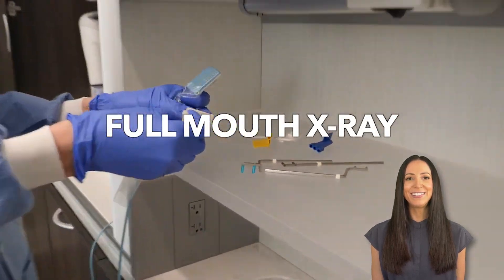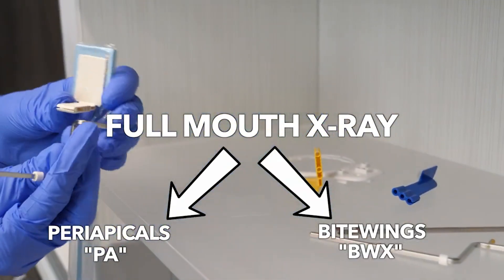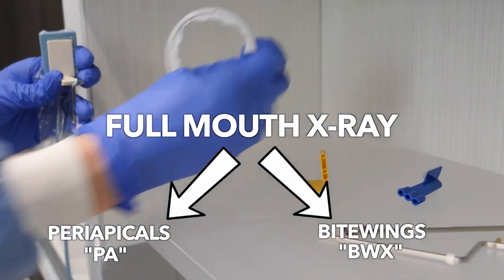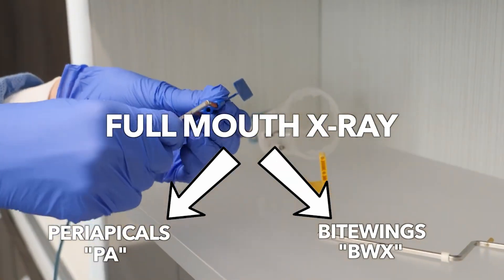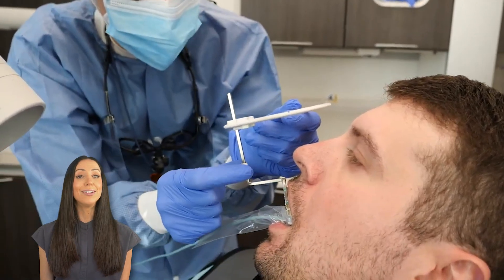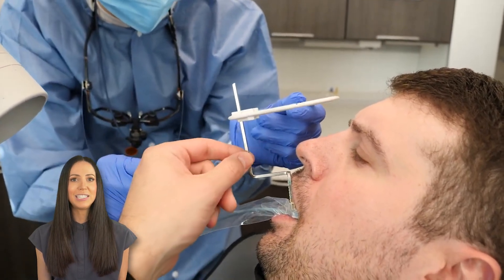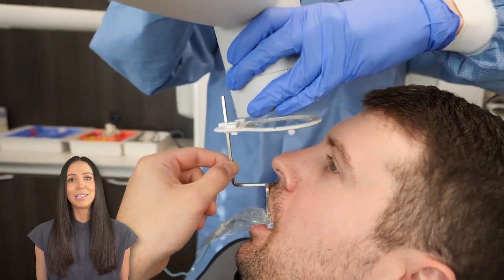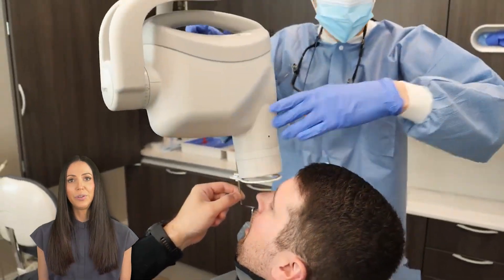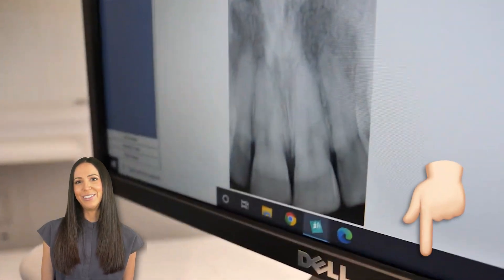A full mouth x-ray is a series of periapicals, PAs, and bite wings, BWX — images to capture a full mouth picture of all areas and teeth in your mouth. We'll talk more about the differences between PAs and bite wings as we go along. Today's digital x-rays don't use nearly as much radiation as traditional film x-rays did a couple decades ago, but even then they were still safe — now they are just even safer.